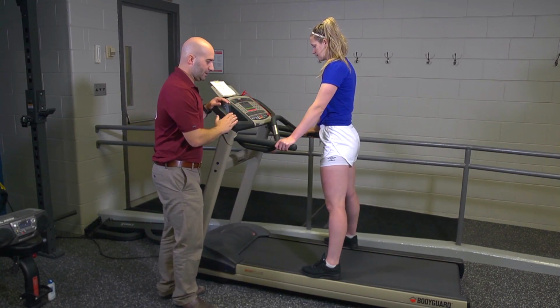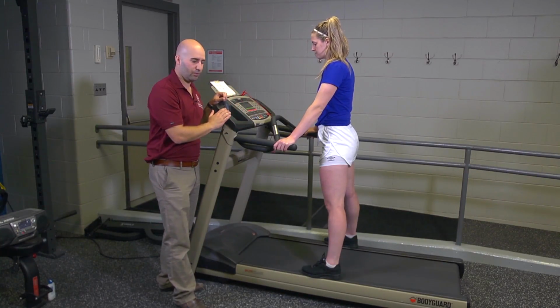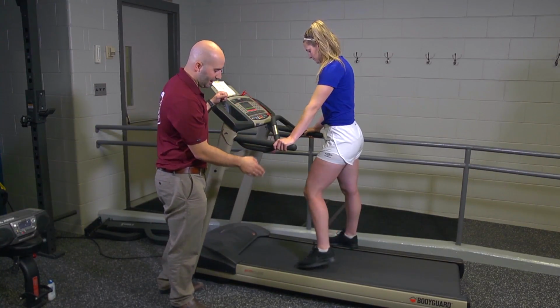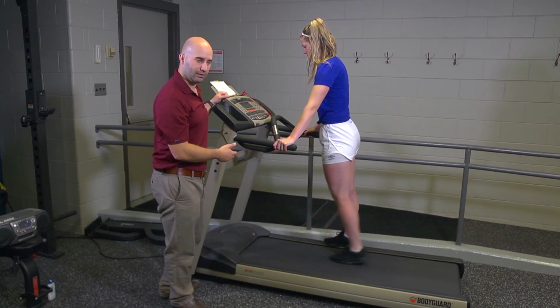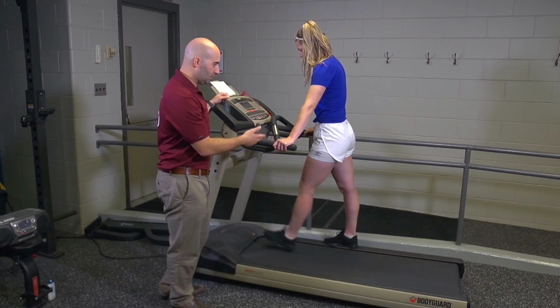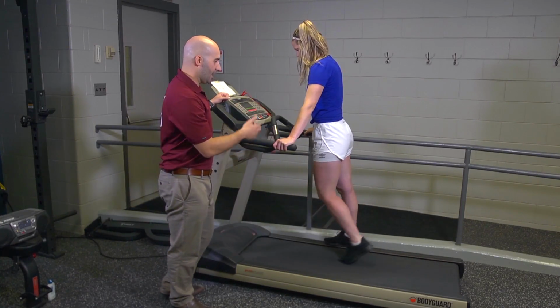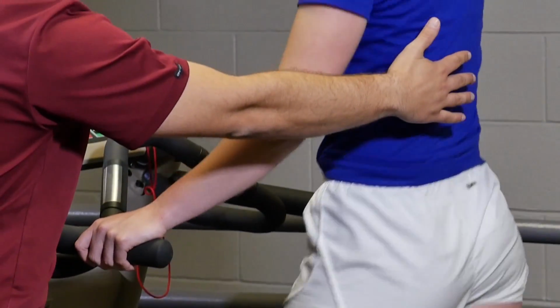So now that we're in this position, what I would instruct Clara to do, now that I know that she has used a treadmill before, is to just take her left leg and drag it back so she has an idea of the speed of the carpet. Right? It could be the right leg, but for the sake of the video, we're using the left. Once she feels comfortable enough with that, I can ask her to put both, and I'm going to put my arm back here just for a little support in case she were to stumble or lose her balance.